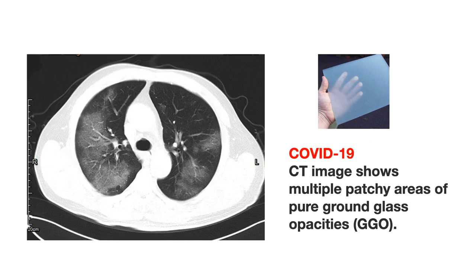In COVID-19 pneumonia the black portion is completely normal lung. The white portions — not completely dense — show semi-translucent black-and-white interspersed granular densities: these are ground glass opacities. These are HRCT patterns of interstitial lung disease showing ground glass density in bilateral lobes, not completely opaque.